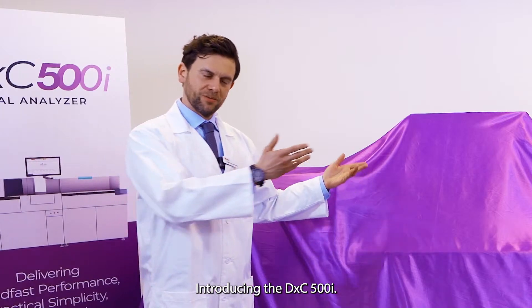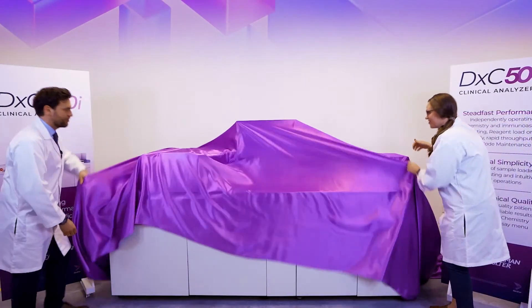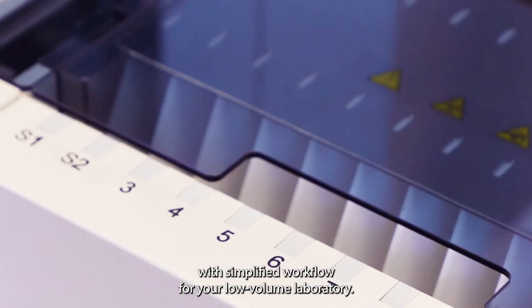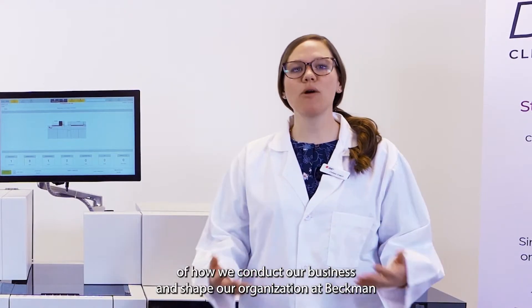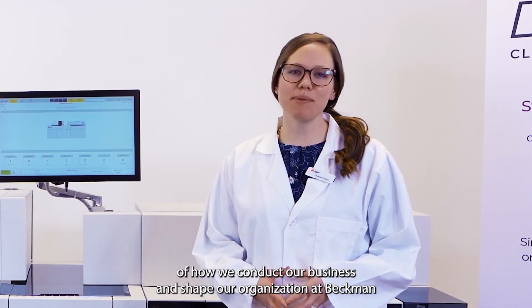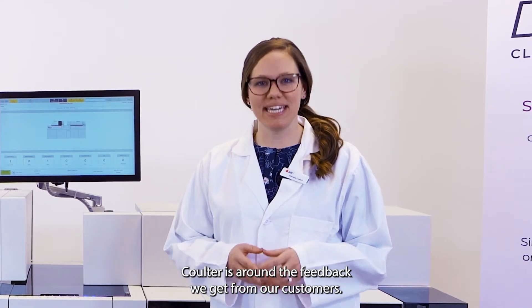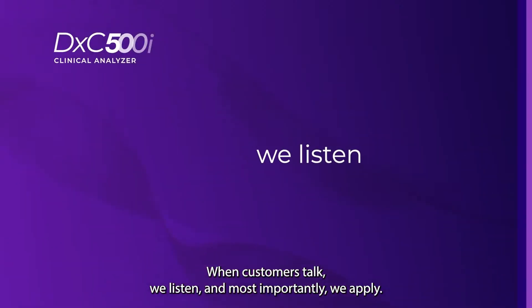Introducing the DxC 500i. Meet your partner for chemistry and immunoassay with simplified workflow for your low-volume laboratory. The key principle of how we conduct our business and shape our organization at Beckman Coulter is around the feedback we get from our customers. When customers talk, we listen, and most importantly, we apply.